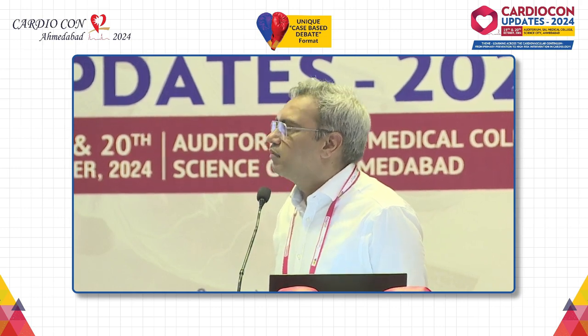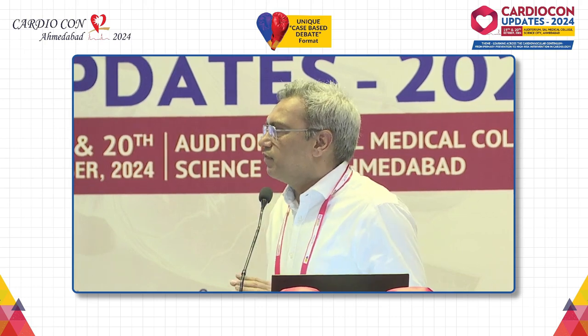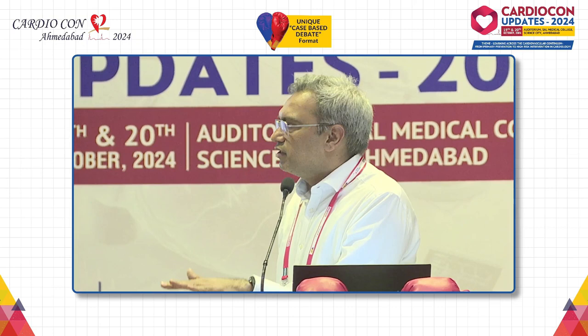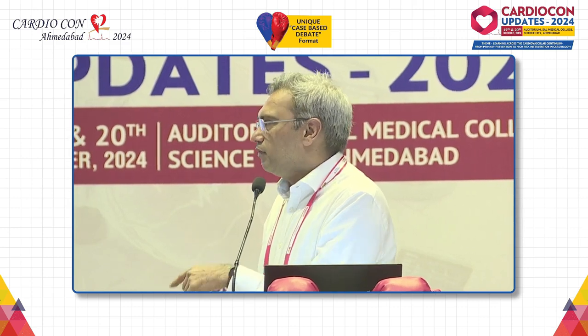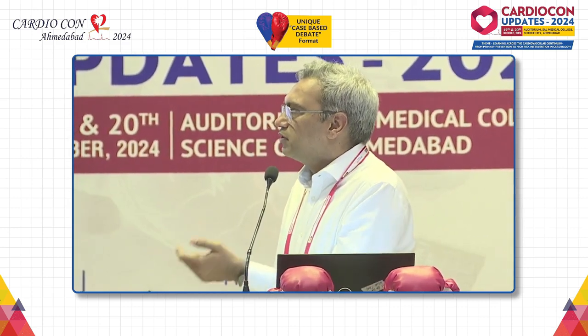Upgrade is not a great solution. So all attempts should be made to prevent a patient from getting an upgrade. So if the patient has LV dysfunction, it is better to implant CRT now rather than upgrading 2 years later when they develop severe LV dysfunction.